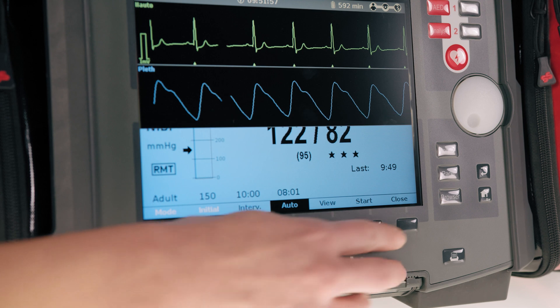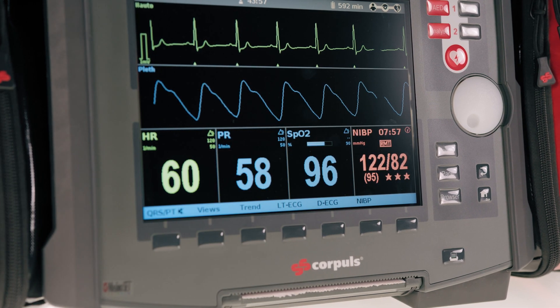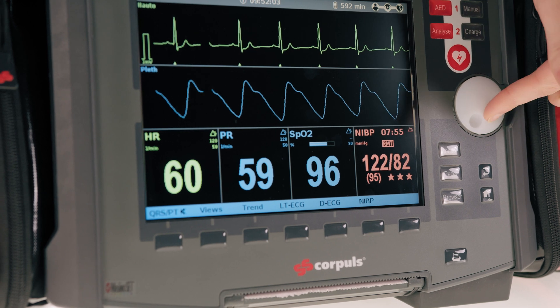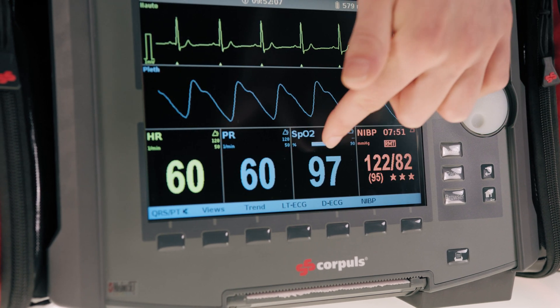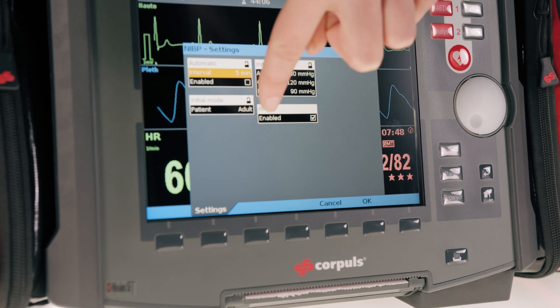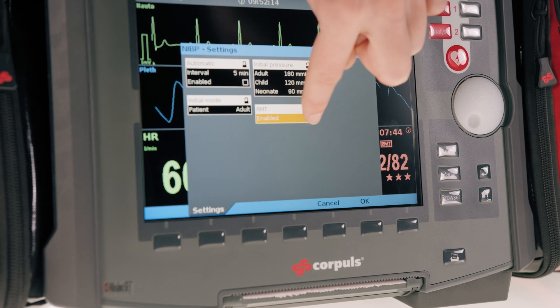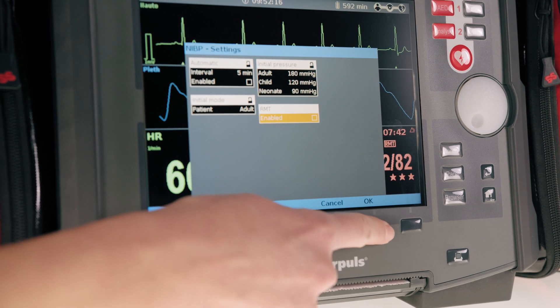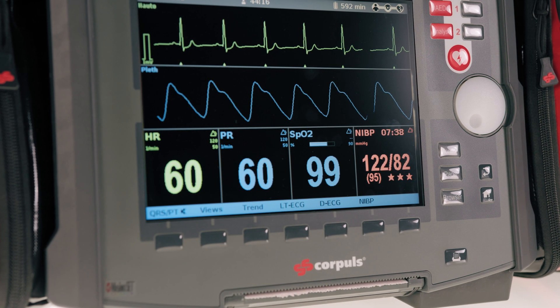To disable RMT, I exit the large blood pressure menu. You see here in the parameter field the RMT is active. Go to the menu, click on NIBP, select settings, and uncheck 'RMT active' at the bottom. Confirm with OK. You can already see here in the parameter field that the RMT symbol has disappeared, which means it is deactivated.